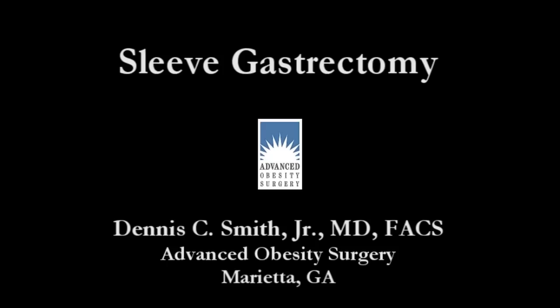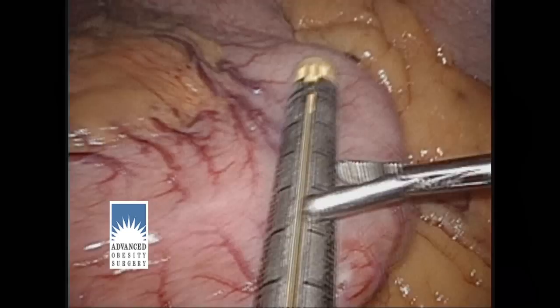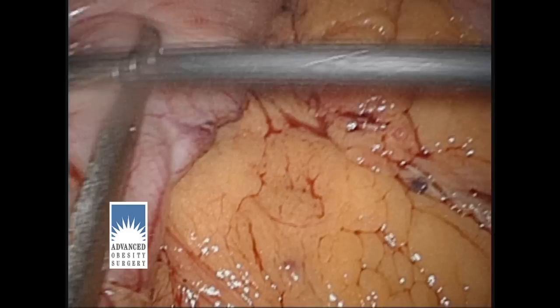Next, we move on to the actual gastrectomy portion of the procedure. We use staplers to put down three rows of titanium staples on each side and then cut in between. We position the stapler and then fire it, starting at the lower part of the stomach where we made our mark and then traveling up along the stomach to the top.